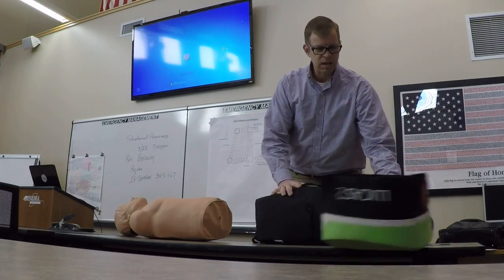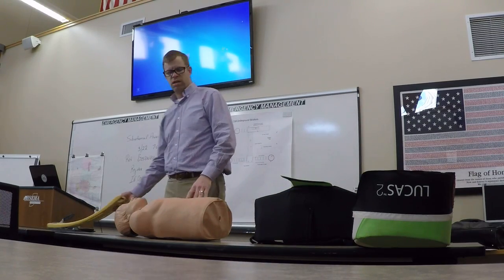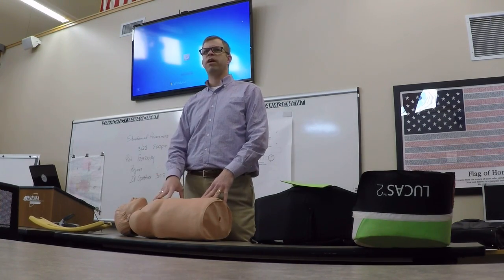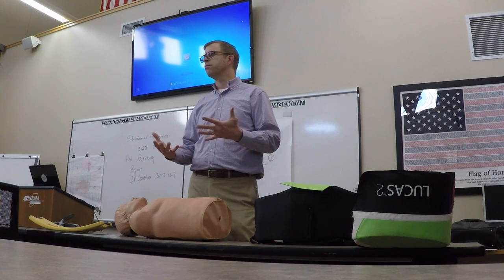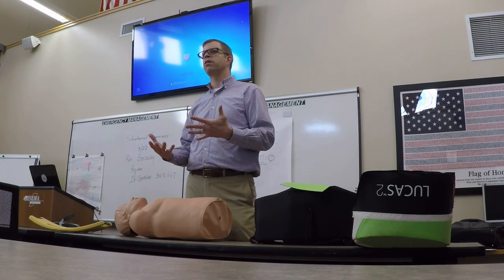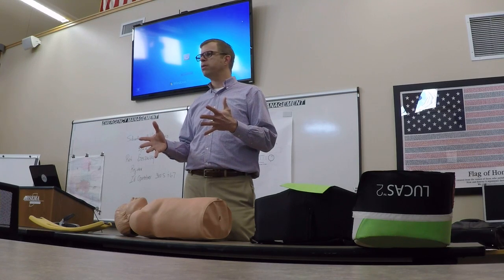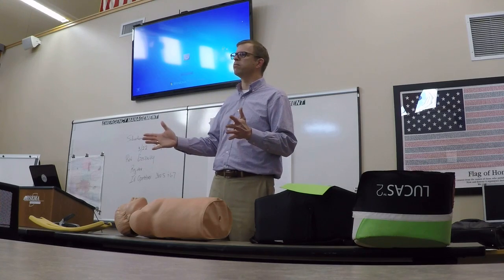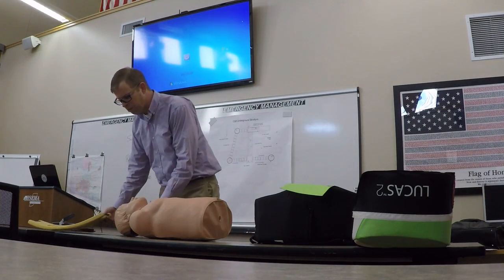Ideally, with multiple people working the scene, somebody could be in charge of getting this device ready while someone else is already doing manual compressions. As I put this device on the mannequin and talk through it, it might feel like it takes a long time to get on. But feedback from agencies indicates that getting it on a patient within a 10 to 30 second time period is extremely reasonable — and that 10 to 30 seconds isn't necessarily interrupting manual compressions, just total elapsed time from when you start to when it's actually going.